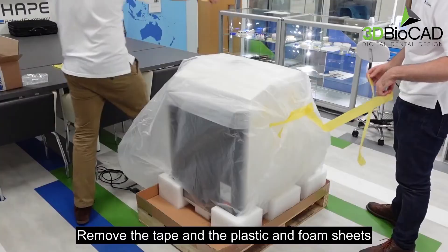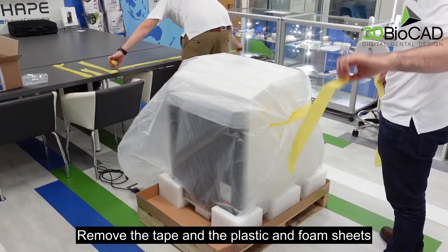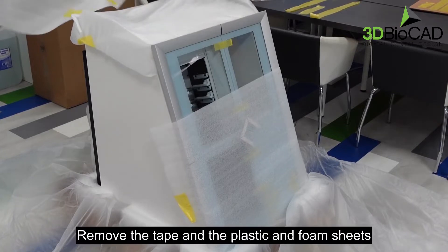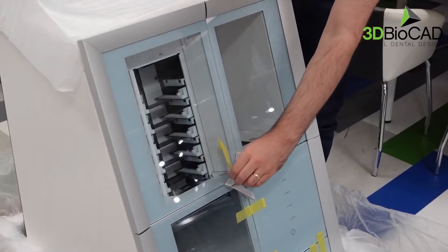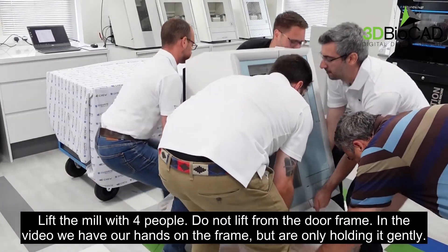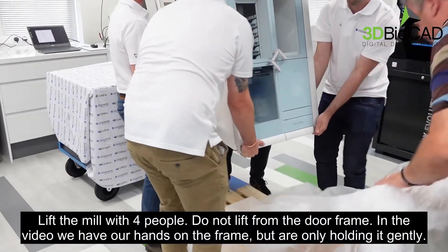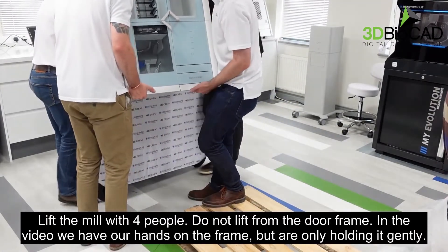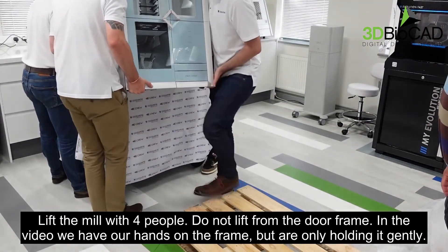Remove the tape and the plastic and foam sheets. Lift the mill with four people. Do not lift from the door frame — in the video, hands are on the door frame but only holding it gently.